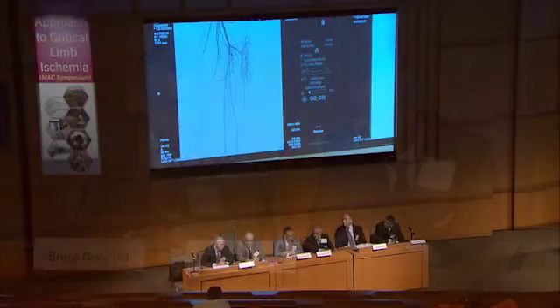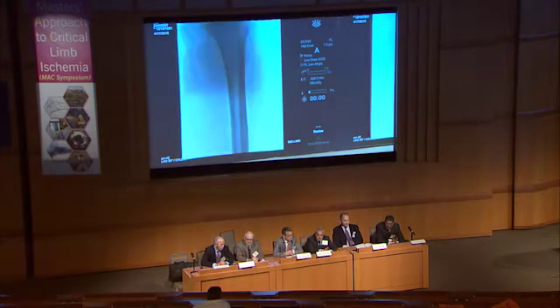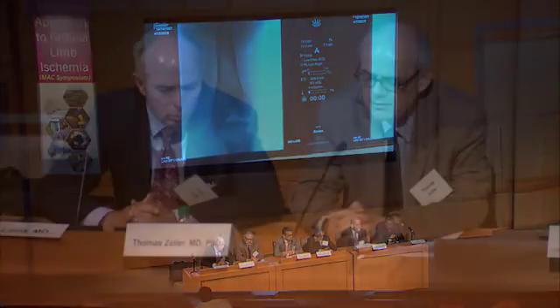Thomas? Yeah, the same. Endo is the only option to solve the problem, including the AV fistula, which is most likely of congenital nature. And it will be interesting to see how much reflux we will see later on after recanalization. And the endo approach, if the SFA would be the source of the fistula, would then be pretty easy. It's implanting a stent graft, and with this you could solve both the occlusive disease and also the fistula.